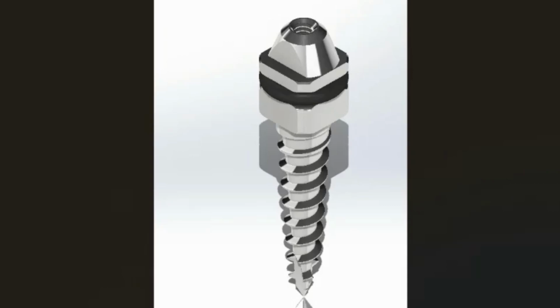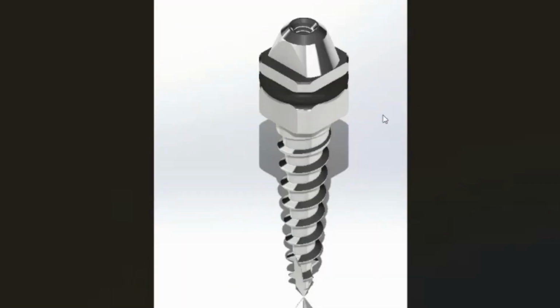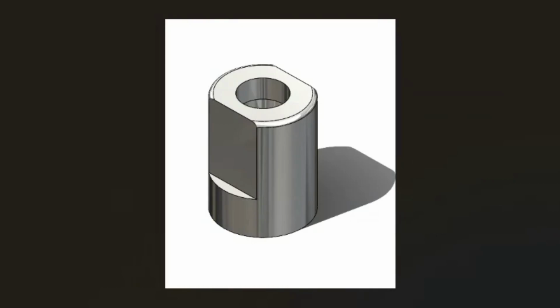And then what's even better, we asked him. We said we need a scan body that we can time, that we can take on and off. So through Keith's efforts, my efforts, and Danny's efforts, we created this scan body. All right. It's got 2 flat sides. You screw it onto this bone screw. You can scan it. Then you can take it off so that it's completely out of your way. And so these are available over at Danny's LA Labs in Louisiana. And I'm not getting any royalties or any payment for this, neither is Keith, but we were just happy to be able to bring this to you.